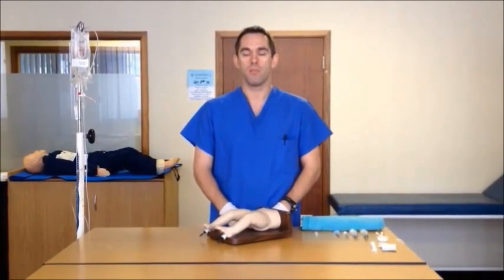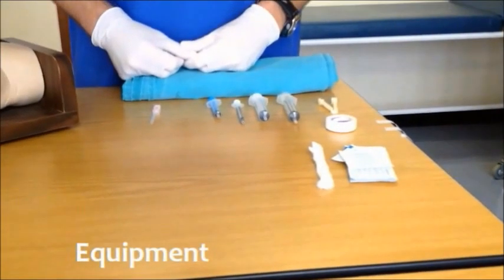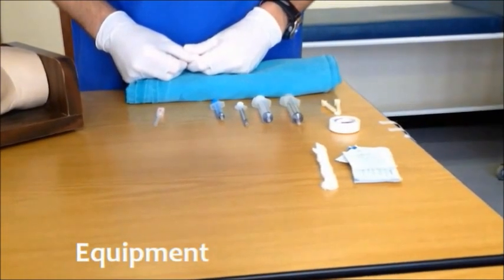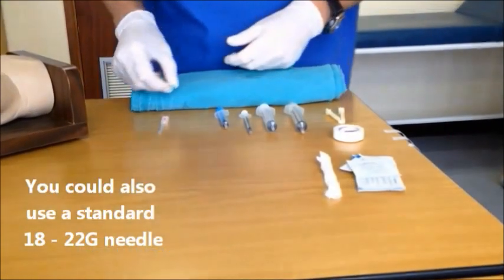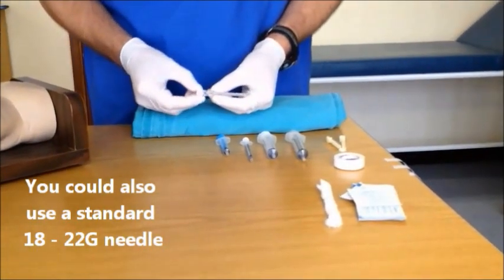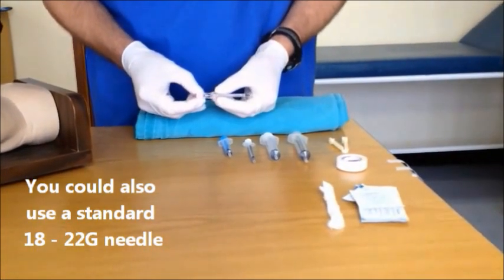Intraosseous access is an emergency procedure to establish vascular access where conventional techniques have failed. Before we start demonstrating the procedure, some equipment. Although there are many excellent commercial devices available for obtaining intraosseous access, these may not be available in the unit where you work. We will show you a technique today using an 18 gauge pediatric spinal needle with stylet, which should be available in most units.